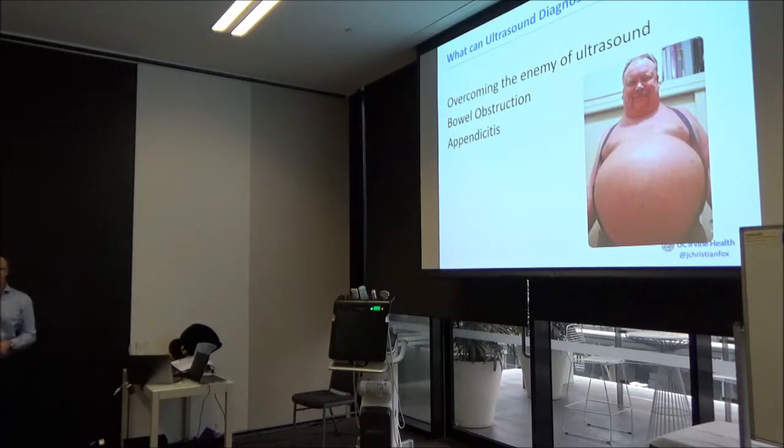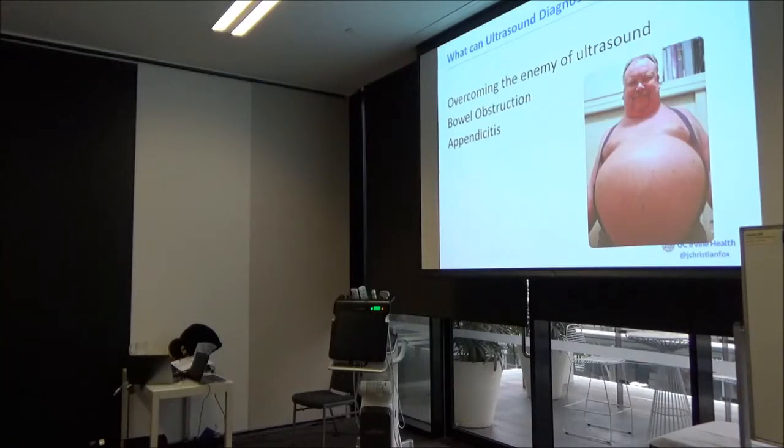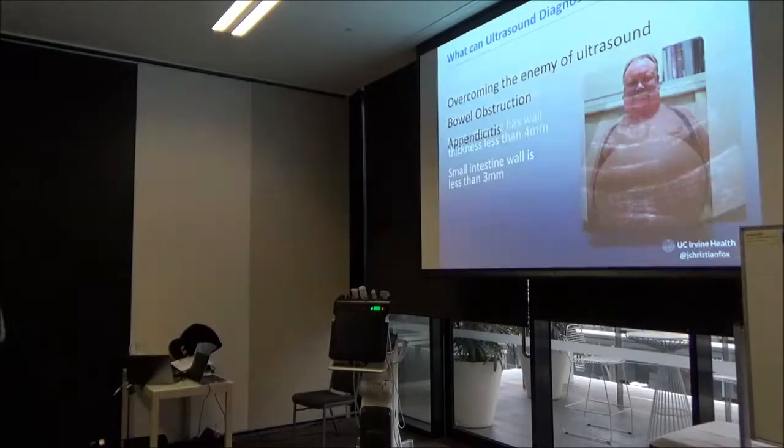I'm going to try to make that argument. And then I'm going to talk about appendicitis, one of my favorite topics of all, because I really think that with ultrasound for appendicitis, we offer our patients so much in terms of avoiding an unnecessary CT scan, expediting the care, and also it does put our sonographic skills to the test. So it's sort of a worthy opponent, if you will.